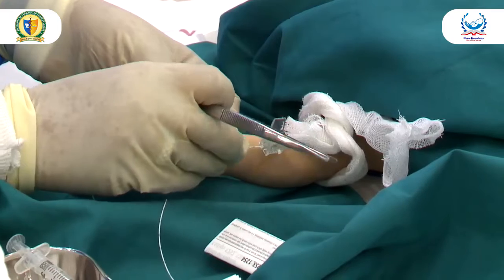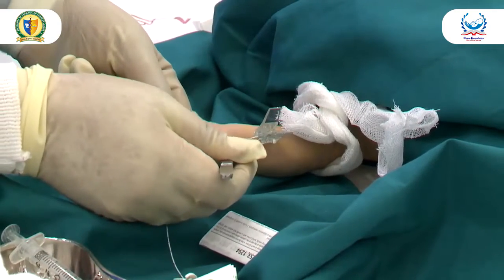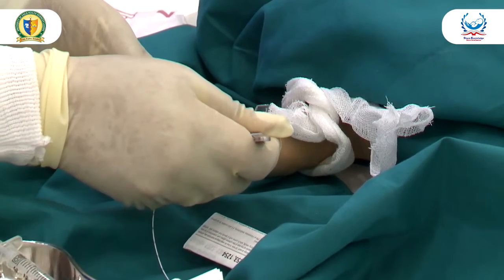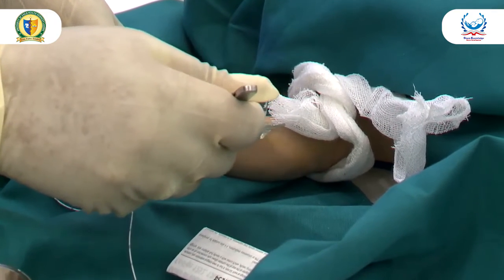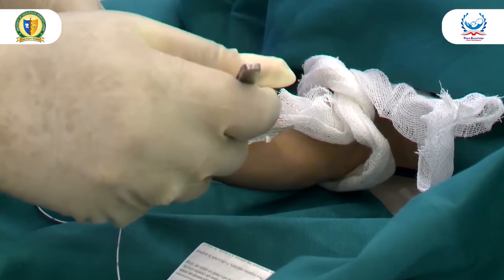While inserting, we can advance our catheter with non-tooth forceps. Tooth forceps may damage that catheter. It is very delicate, so we use non-tooth forceps and gradually advance the catheter to the desired length of insertion that we have already measured.